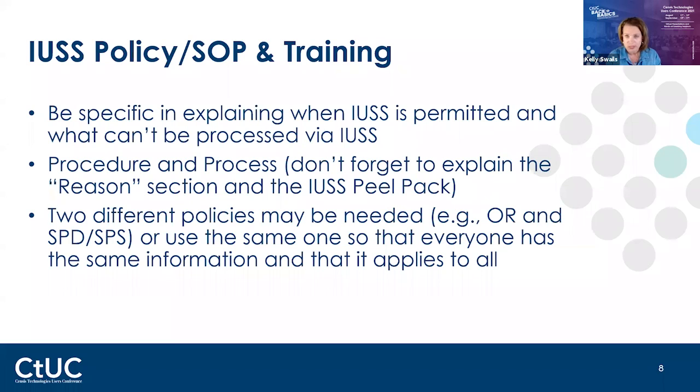You don't want them to compromise patient care. You want them to speak up and say, "Hey, I just contaminated this. I need another one," whether it's a tech, a doctor, a med student, whoever. So we need to make sure that we are writing that policy so that it doesn't come across as shaming, writing it so that IUSS is a total last resort.